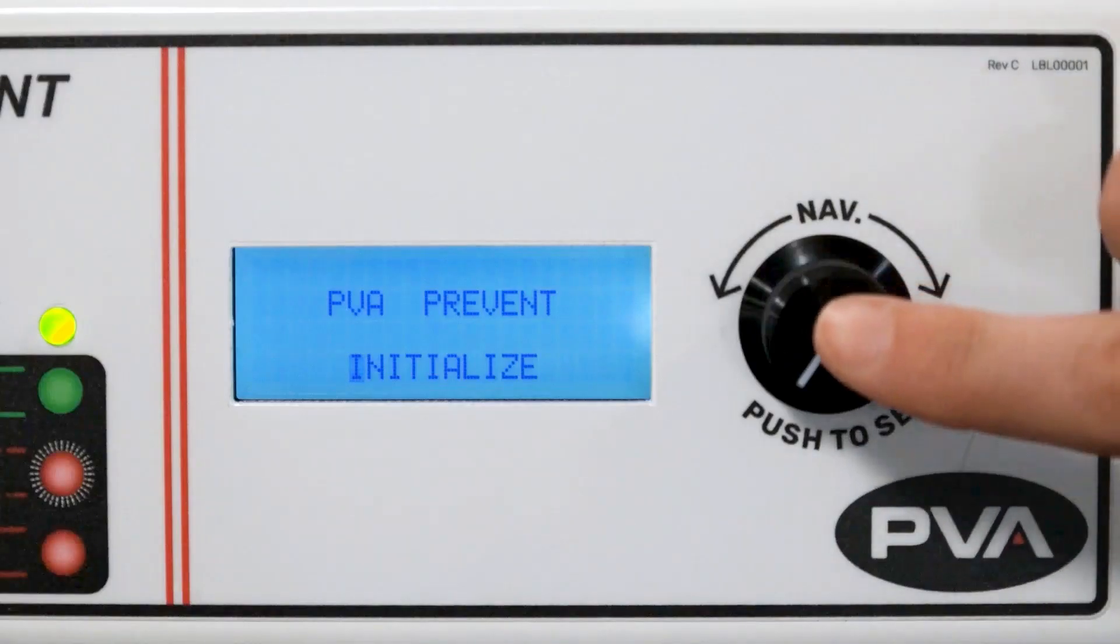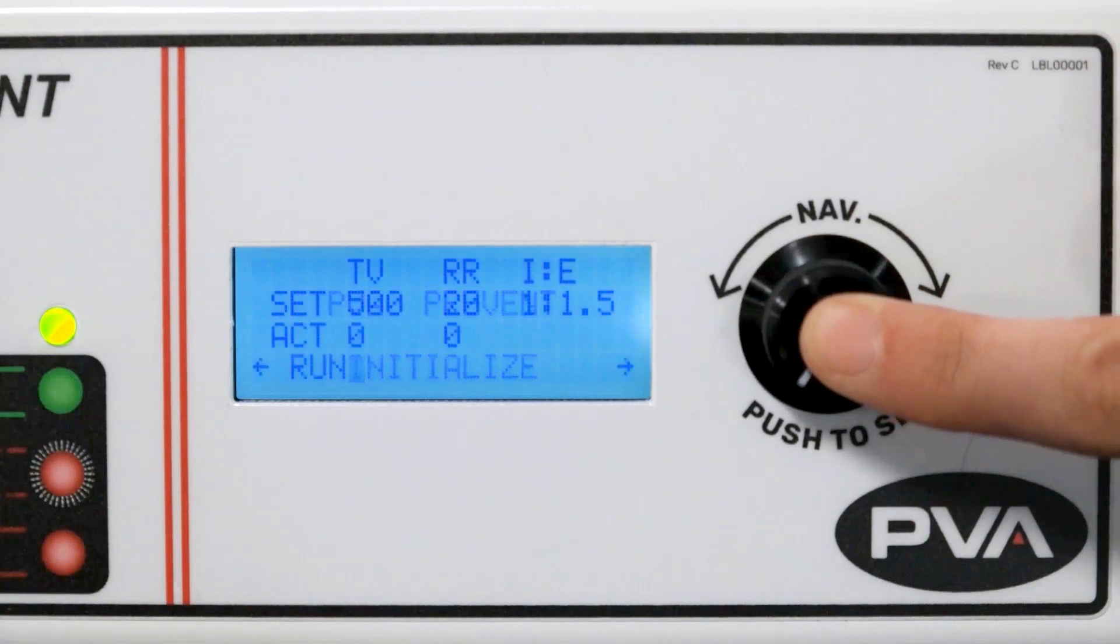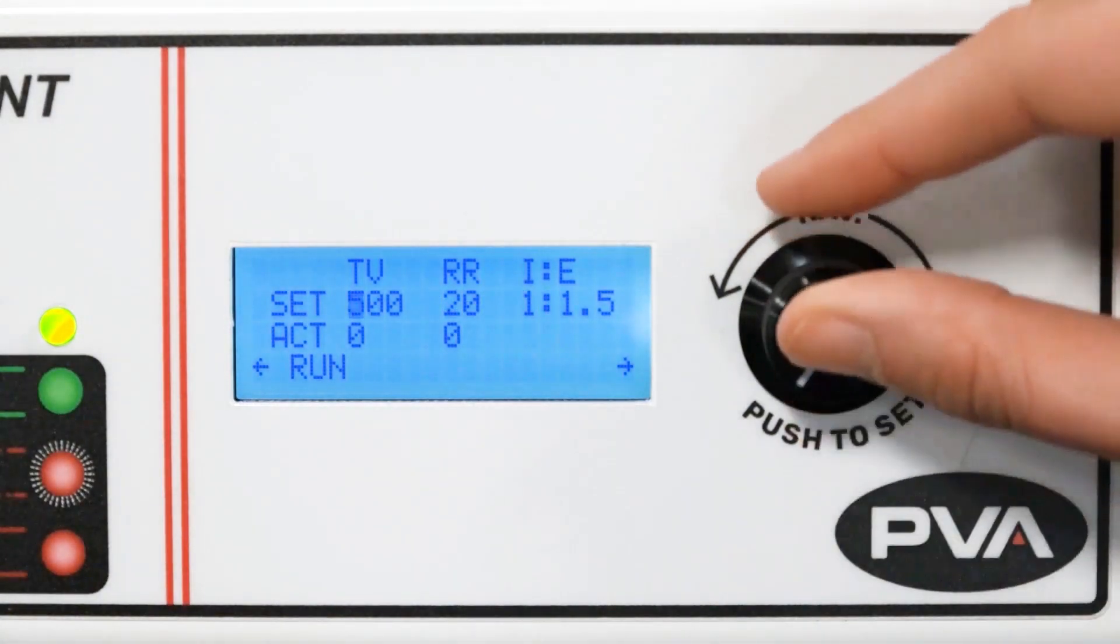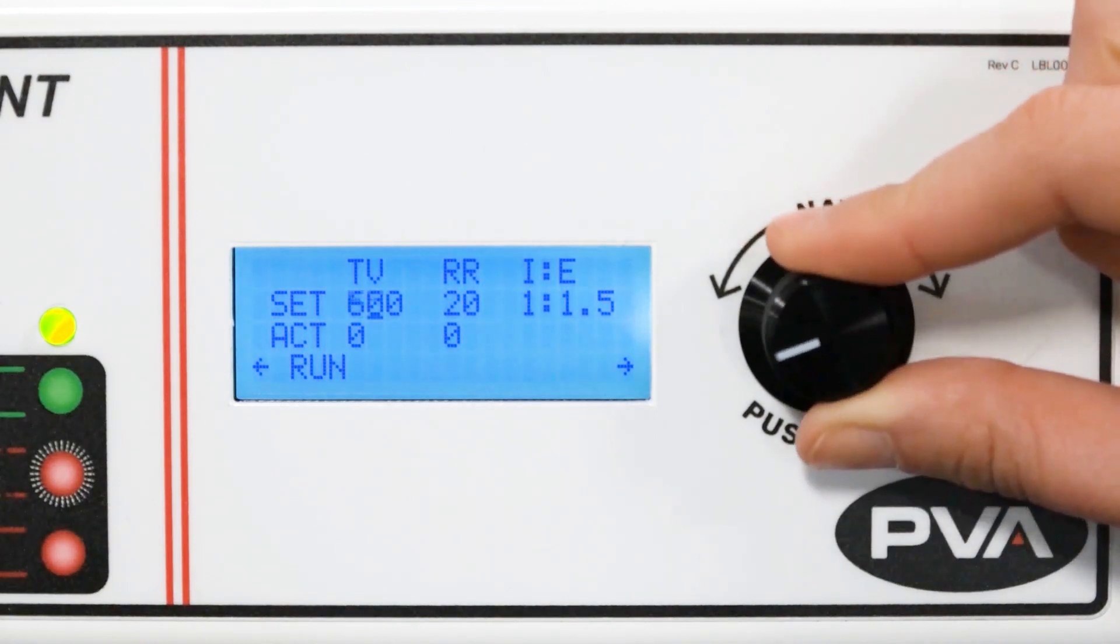Press the knob to select initialize on the startup screen. You will automatically advance to the next screen. On this screen, you will set your tidal volume, respiratory rate, and inspiratory to expiratory ratio.